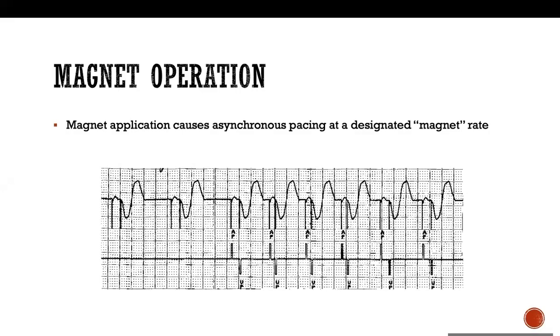So why do we do all of this adjustment? We're afraid that if you're going to use cautery, the electrical signal from the cautery is going to create some noise around the device, and the device is going to see this noise and sense it as electrical signal coming from the ventricle, and it's going to inhibit pacing. For that to happen, you need the patient to be pacing for a lot of time, and you need to have the cautery on for a very long time. That's why you think about adjusting the pacemaker. If the pacing is not going to be all the time, and it's very, very unlikely that the surgeon is going to use cautery all the time, the amount of cautery is minimal and the amount of pacing is minimal. So you don't really need to adjust that pacemaker setting.